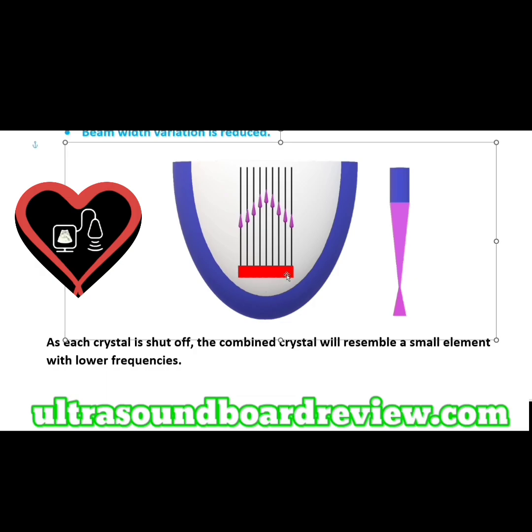And as a result, we're going to have higher frequencies. If we start off with all the crystals firing, this will represent a large thin crystal, which means we're going to extend our focal depth. The focal depth is anywhere from the beginning of the transducer to the focus. You could also say this is the near field or the Fresnel zone. But really, we're extending the focus deeper into the tissue.